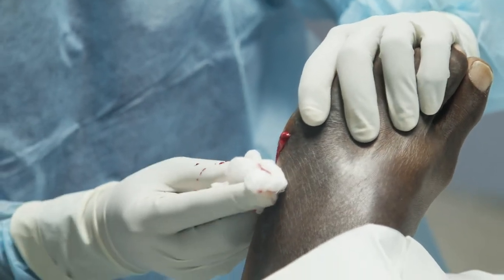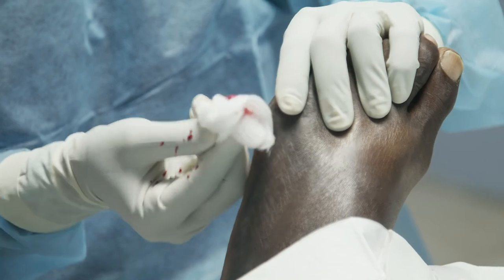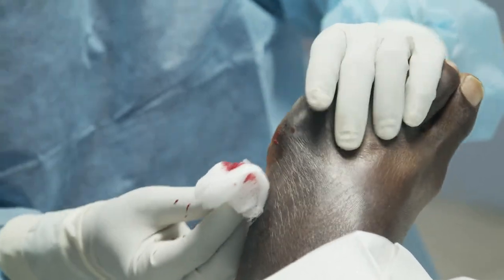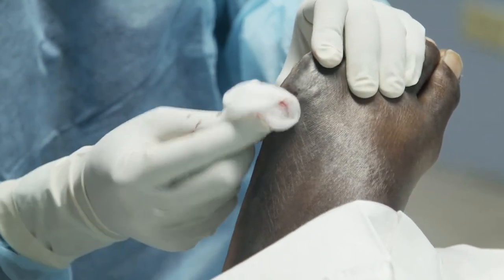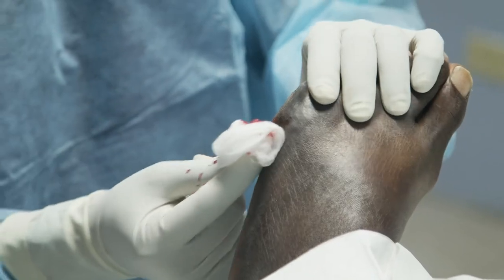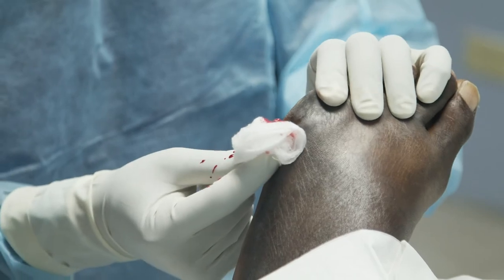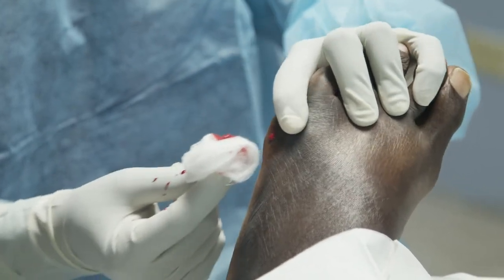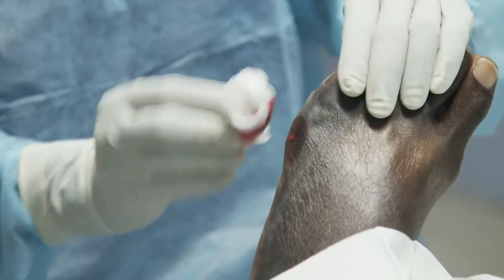And this is bone paste that's gonna come out. Okay? See that stuff? That's bone paste. Now, this is one of the reasons it heals so well. So now the joint is no longer plantar flexed. It's going to be level like that, okay? And the bone paste is going to enhance the healing because bone paste has, guess what in it? Stem cells. It's his own stem cells. Boy, that's good stuff, okay?